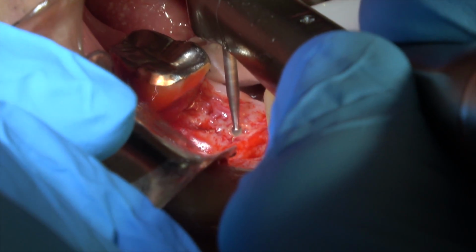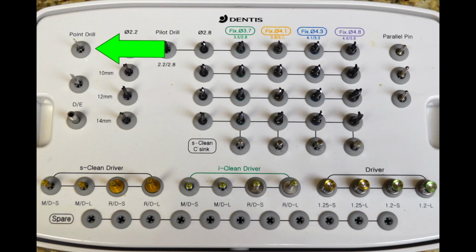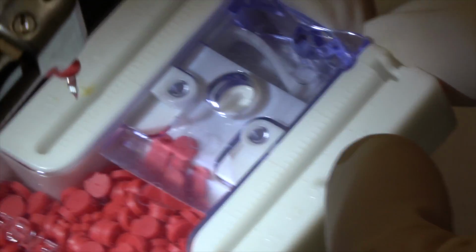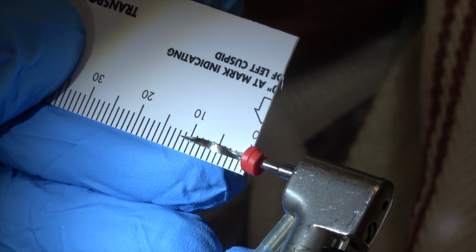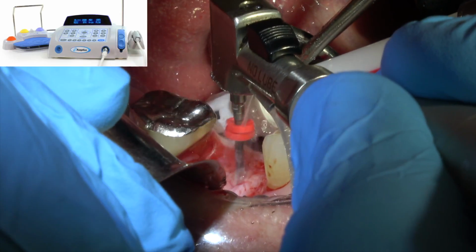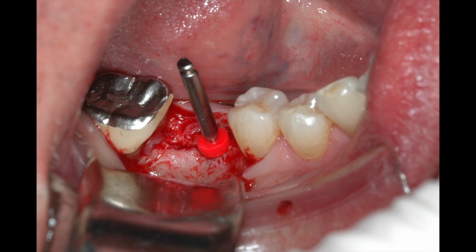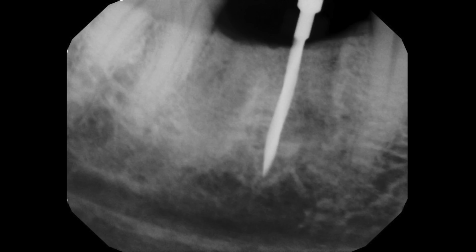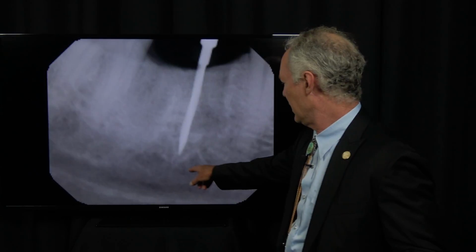Now I measured on my digital radiograph, 10.6 millimeters. So I'm going to take a pilot drill and put an endo stop on the pilot drill and measure that. Now that's 10 millimeters. So I'm going to go about 9 millimeters into the bone with the pilot drill, and then I'm going to take a radiograph. And you can see, here's the nerve right here. I've got plenty of room.